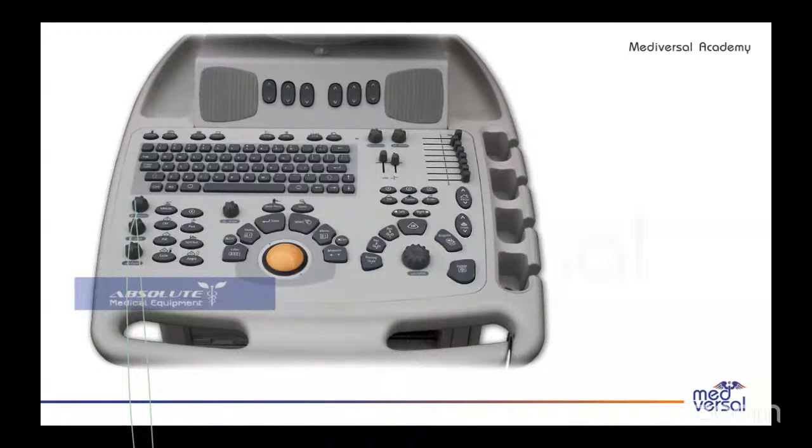Acquire is basically to acquire the image on the screen or to save it. Freeze is when you have to freeze the film which is going on, right? And 2D is to come back to the previous one. It's the 2D button, right? And record is basically to record the film.